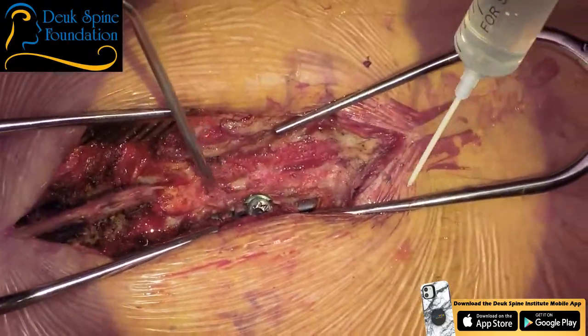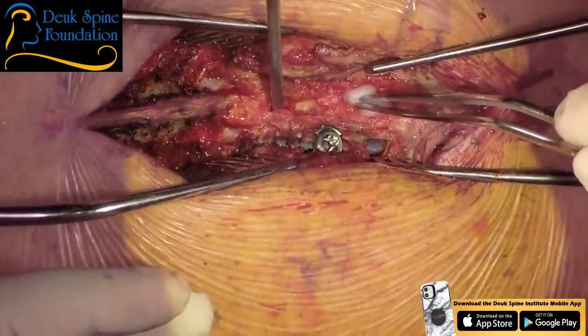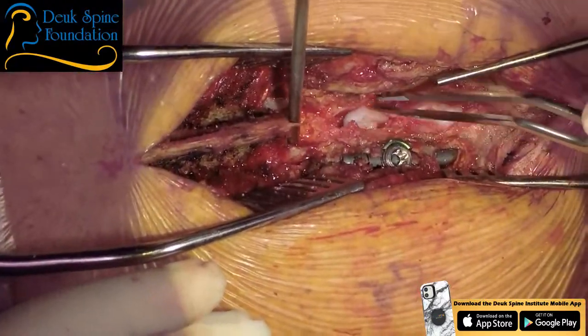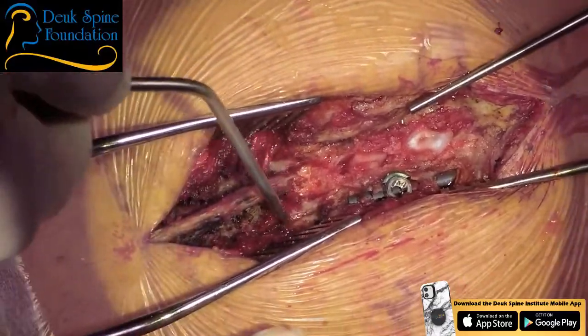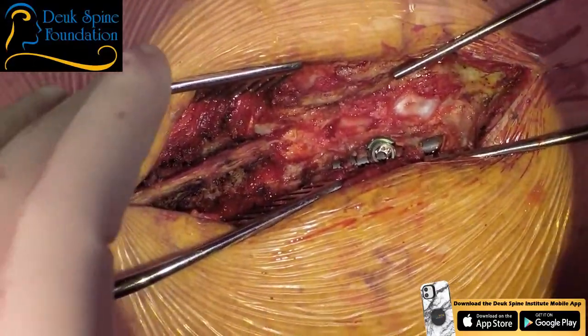We've got probably another 45 minutes. We'll be closing. I should be done with the decompression and onlay fusion. Am I gonna put a drain? Yeah. I don't know. It's kind of on the border.